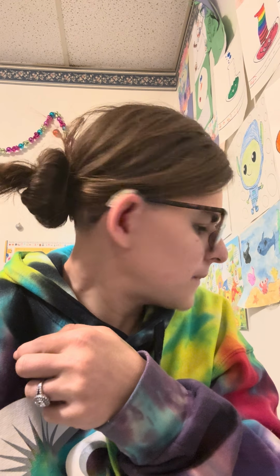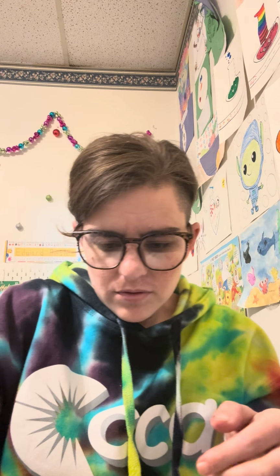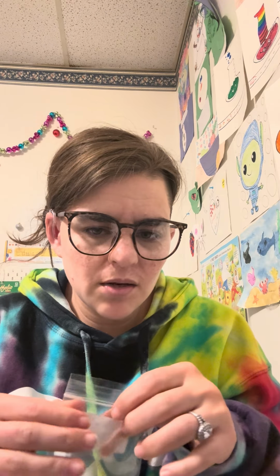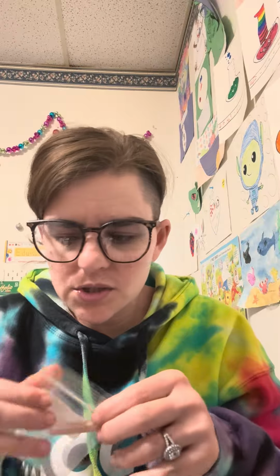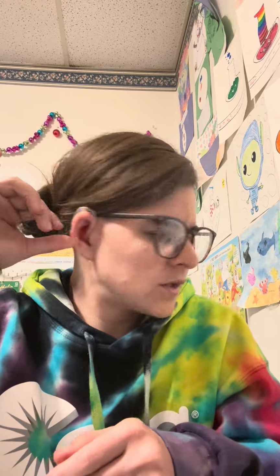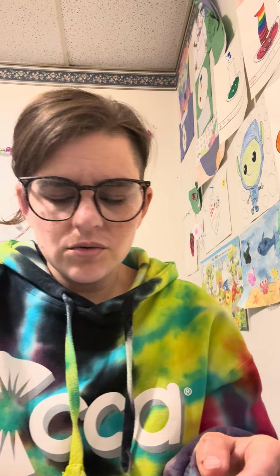All right. So thank you to my friend for giving me this tube puller, because I had difficulty getting it in my new mold. The hole was just tighter than it normally is, and I don't know if that's because of the way they made it or because it was new. The tube puller is from a friend who wasn't using it, and it makes it easier to stick it through the hole.